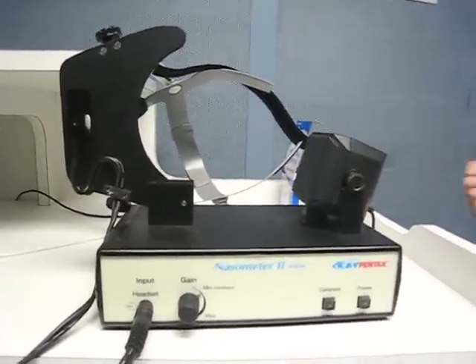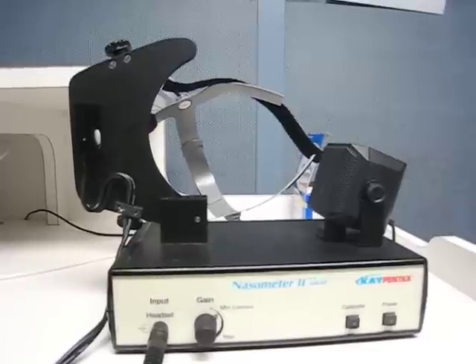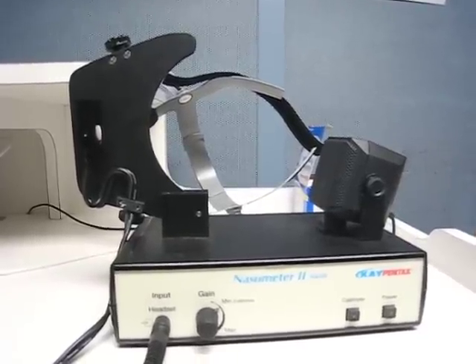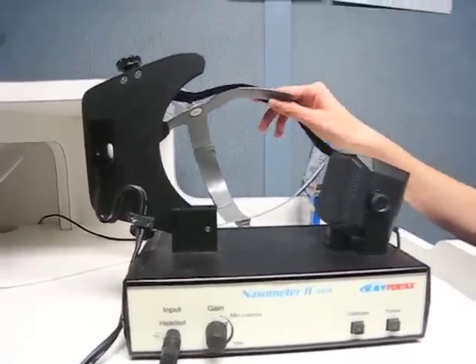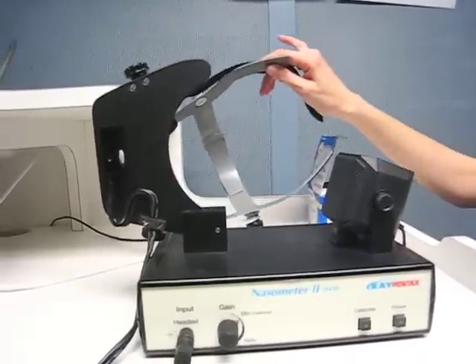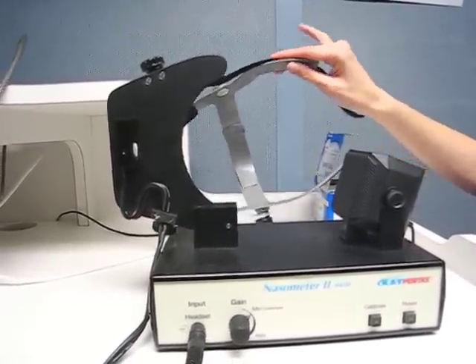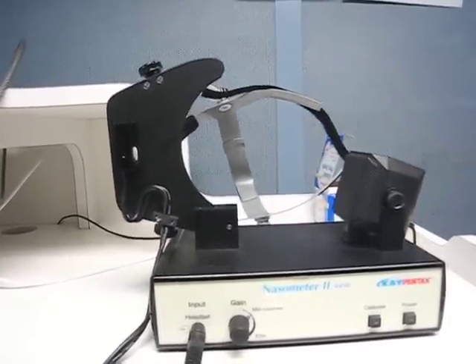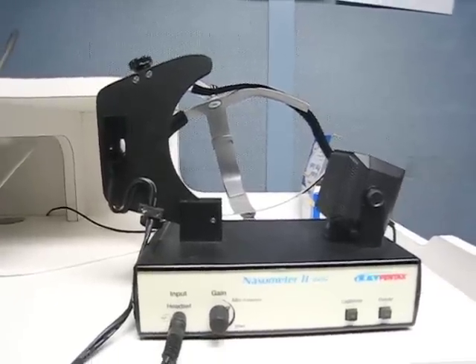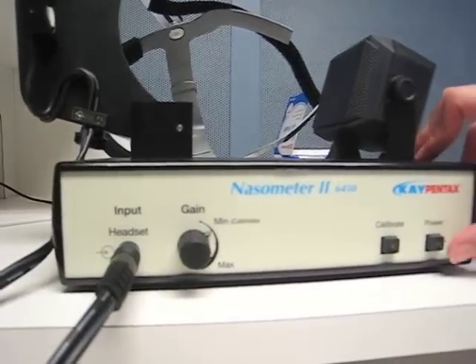To minimize reflections from the calibration tone, the headset, headband, and harness need to be directly behind and far away from the microphones during calibration. Make sure it's all the way behind — directly behind and far away. Make sure the gain on the Nasometer 2 hardware module is set to the minimum calibration position, and then turn it on.